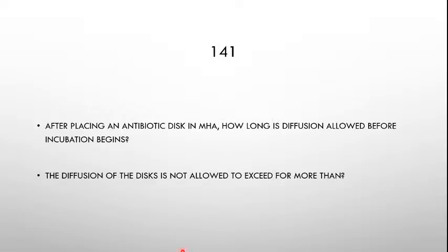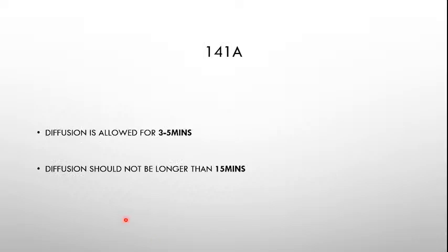Okay? Now, after placing the antibiotic disc in MHA, how long is diffusion allowed before incubation? Sir, talaga tinatanong din siya? Yes, of course. Actually, you have to allow it to stand for 3 to 5 minutes. Otherwise, there is false spreading or there could be false resistance or susceptibility. Okay? So, diffusion should be no longer than 15 minutes. Hindi pwedeng more than 15 minutes.